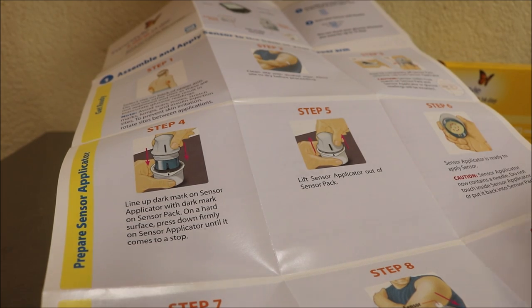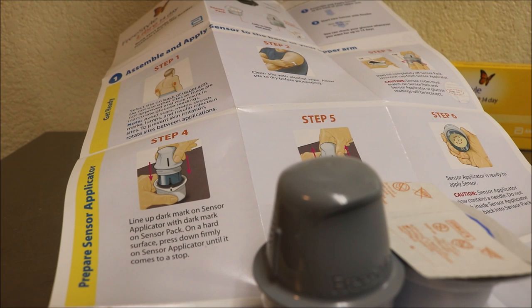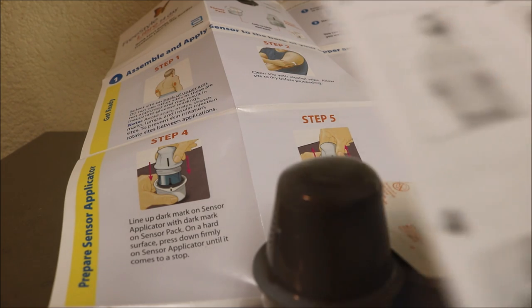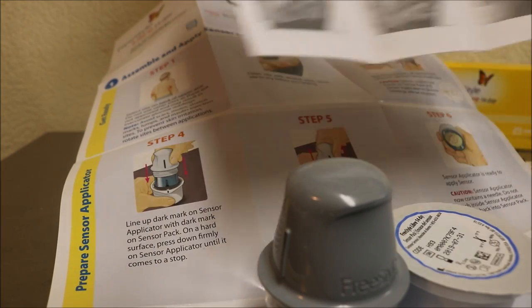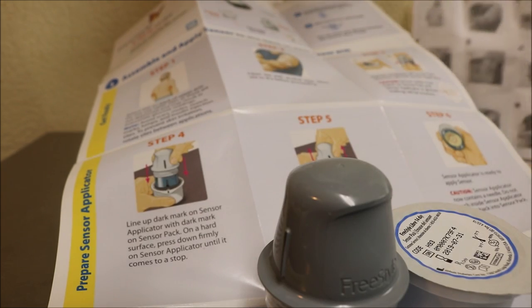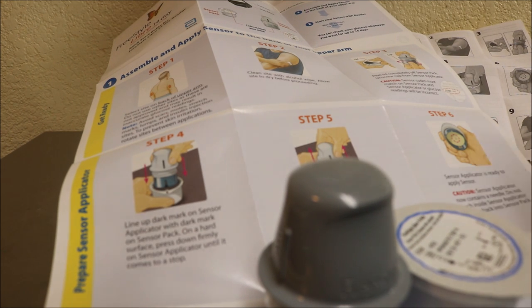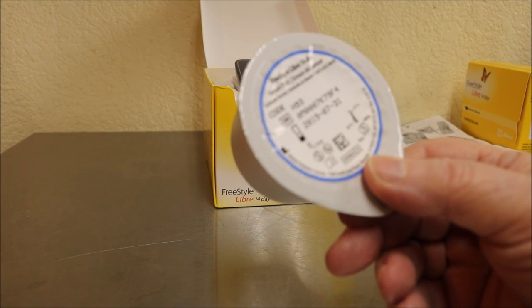Here's the sensor pack — looks like it was already open. Here's sensor one, here's sensor two, and here's the alcohol wipe. There are also Spanish directions inside. We actually started learning Spanish when we lived in Africa, but anyway — I'm not going to do the cross-body application shown in the directions. I'm going to do the bent elbow one because I'm deformed in areas.